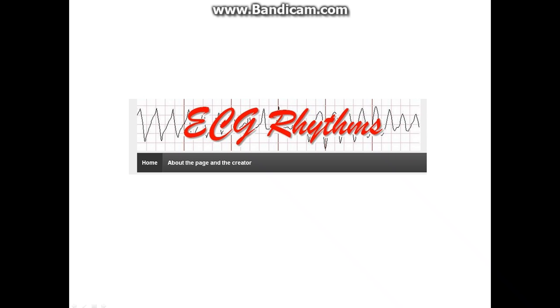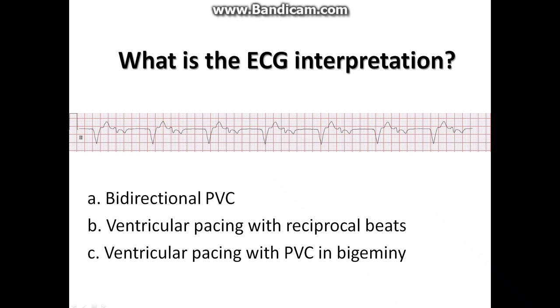Hello, this is Arnold Carmona of EKG Rhythms. I have an interesting strip today — this is the long lead 2. What is the interpretation? Letter A: bi-directional PVC. Letter B: ventricular pacing with reciprocal beats. Or letter C: ventricular pacing with PVC in bigeminy.